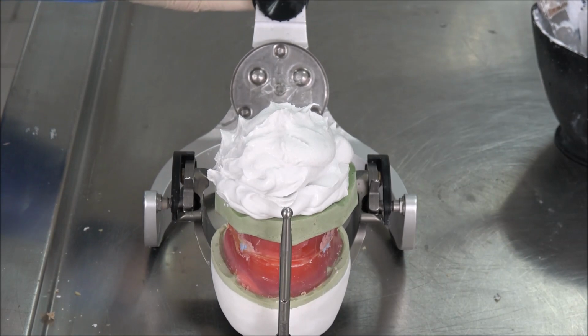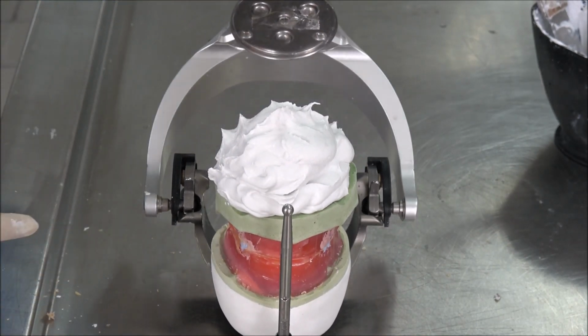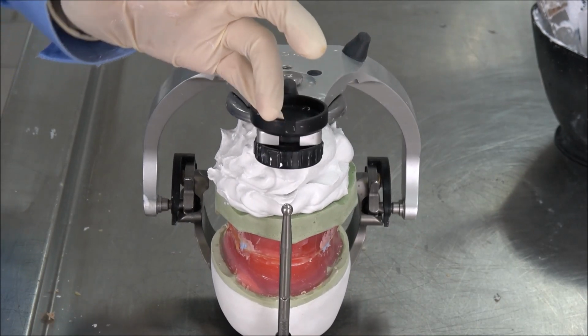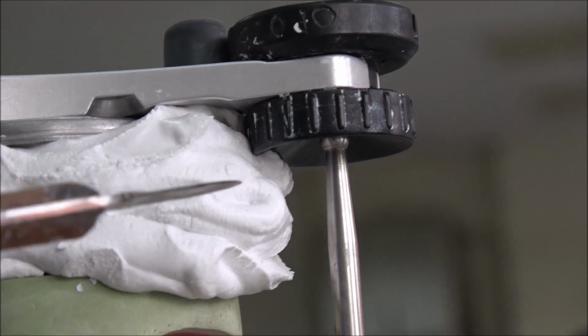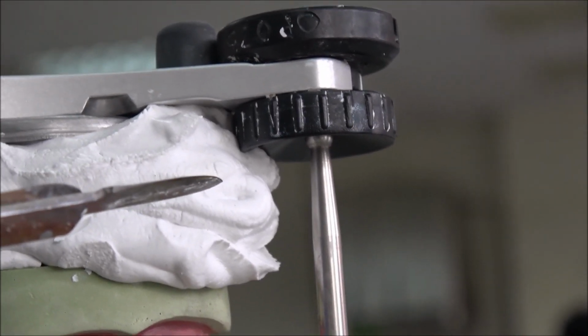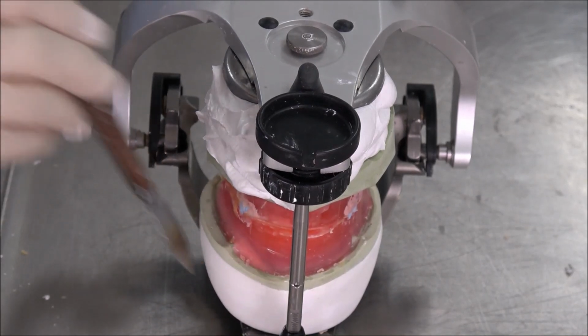Just close from the base. Close it slowly and check. Make sure it sits properly. Okay, same to the upper model.